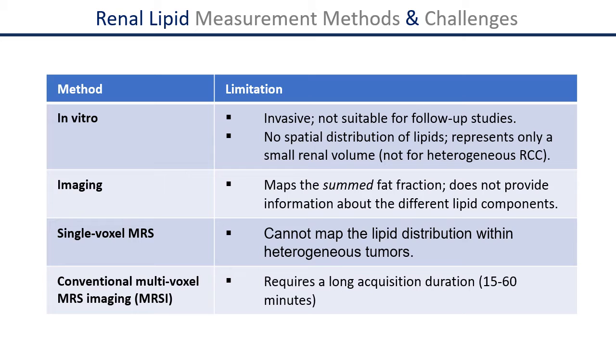So, the conventional multivoxel MRS imaging can deal with heterogeneous tumors. However, it requires a long acquisition duration, ranging between 15 to 60 minutes.